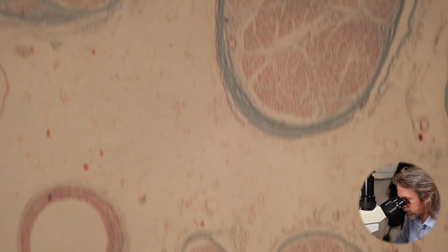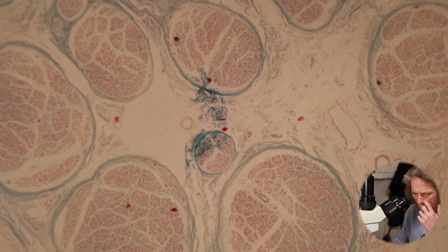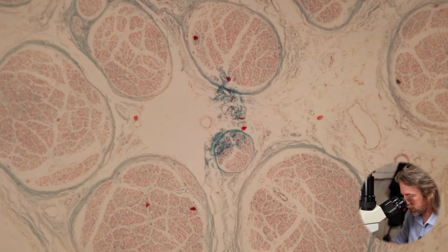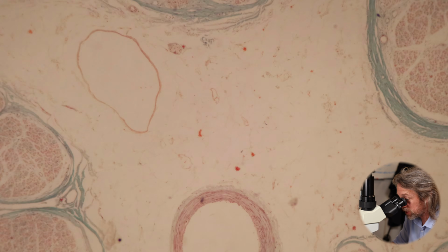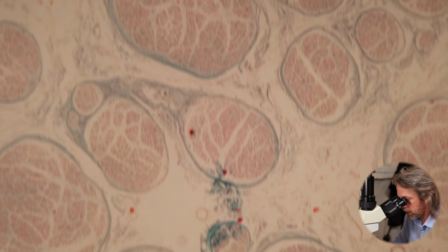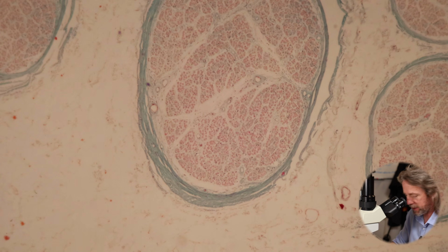And we can see lots of bubbles. We can see lots of circles. A little bit brighter maybe. So we can see lots of circles. This is the sciatic nerve. We can see in green there connective tissue. It's mostly nervous tissue. There are going to be some blood vessels in there as well. Like in many parts of the body we're seeing those four main tissues coming together, or at least three of them.